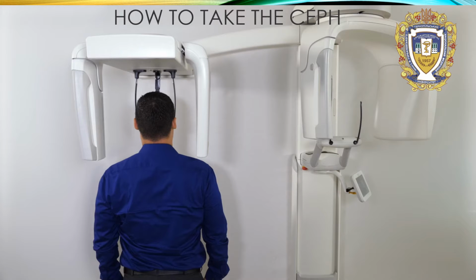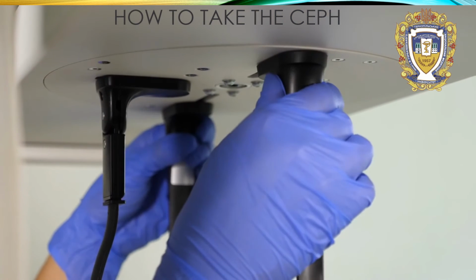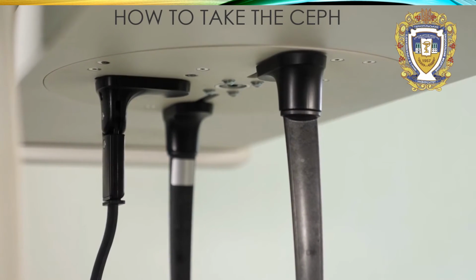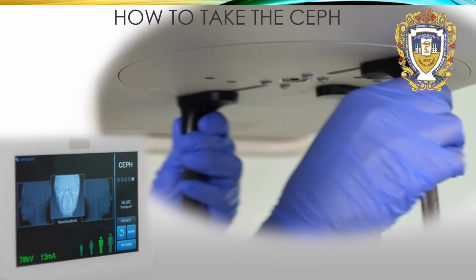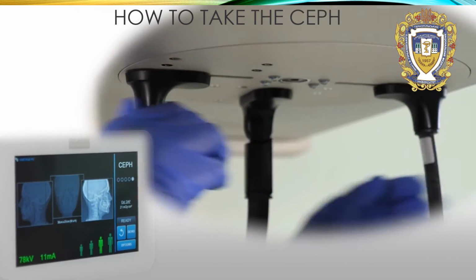The otic posts are in line with the X-ray tube head. Rotate the cephalostat to the proper position based on the desired function or study type. Rotating the cephalostat will automatically configure the system for the chosen cephalometric study type.